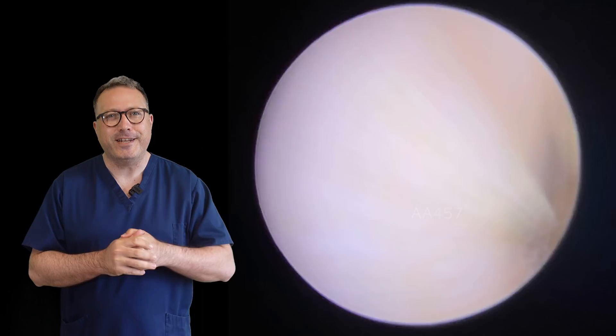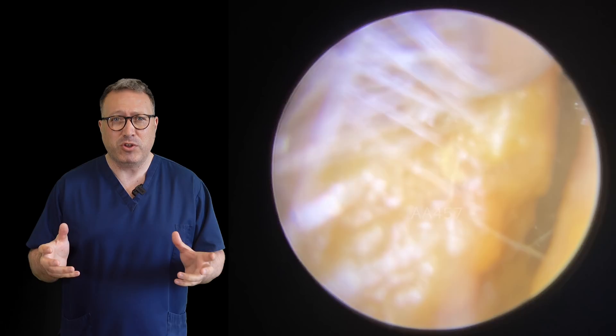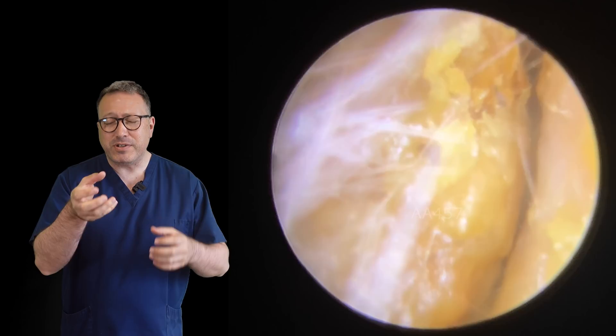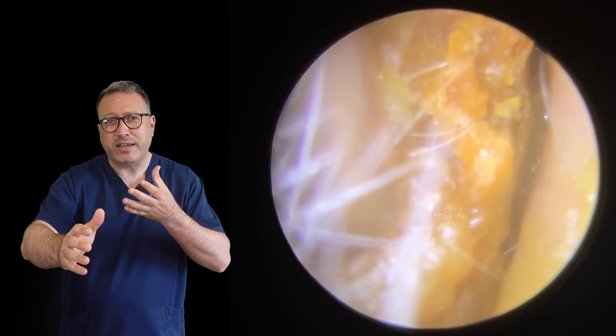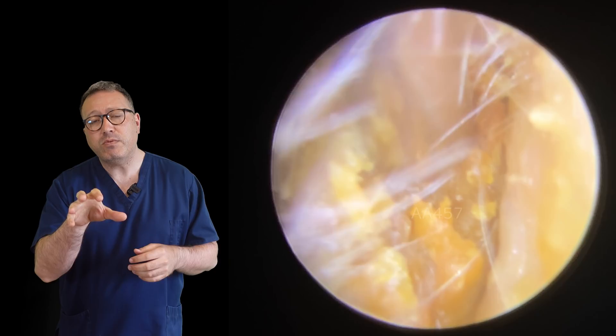So what you can see with this patient — a lovely lady who came through to clinic yesterday — she was very, very blocked up in both ears, bless her. Really having a lot of difficulty with her hearing and a feeling of fullness in the ear canal. She has been to see us historically and also to the NHS. What you can see here is a very dense collection of very small skin flakes, all dry together, with some wax and some long skin pieces as well. So lots of dry skin contributing to this problem. The patient experiences a little bit of itchiness in their ear canals, which can happen with dry skin.